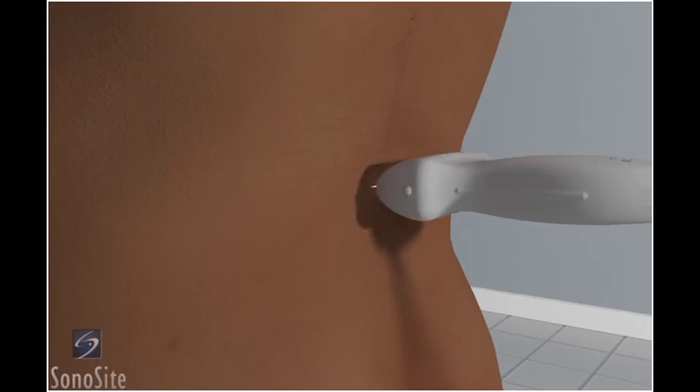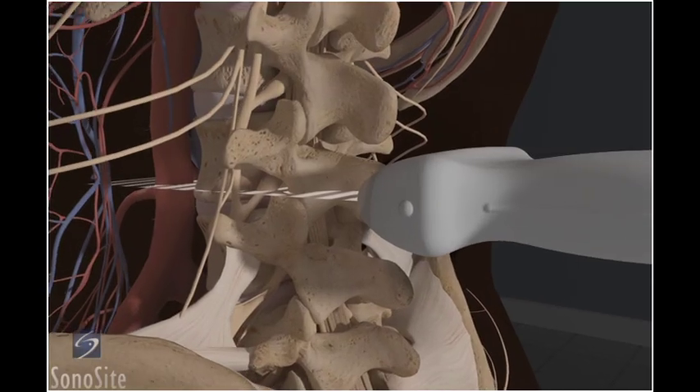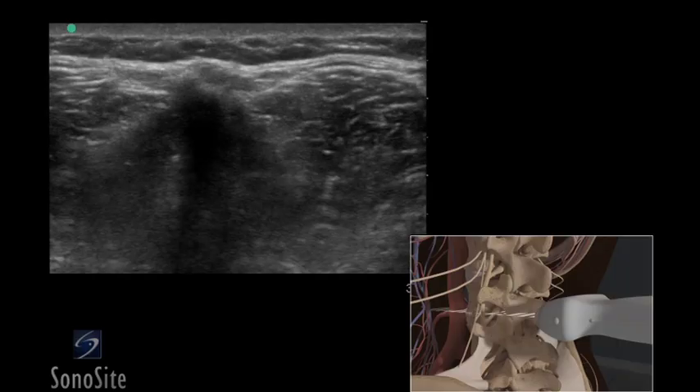The transducer is placed in a transverse direction with the orientation marker directed toward the patient's left side, in the middle of the back at the level of the iliac crests. The spinous processes will appear as distinct hyperechoic peaks with acoustic shadowing below, and define the midline of the spine.